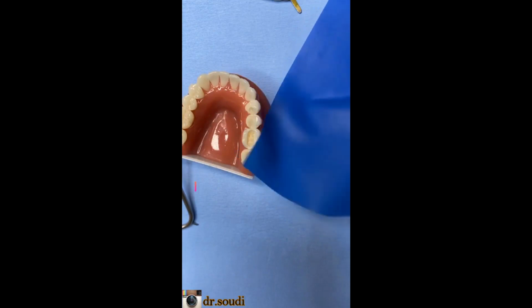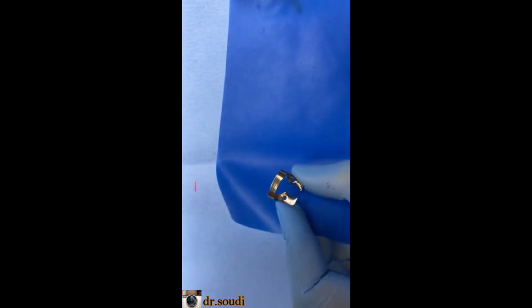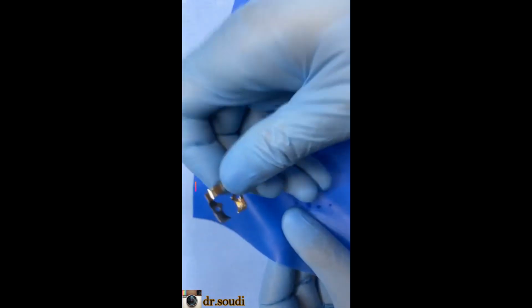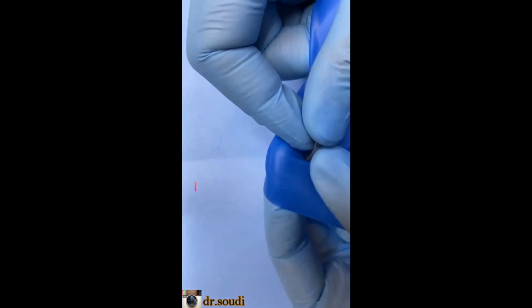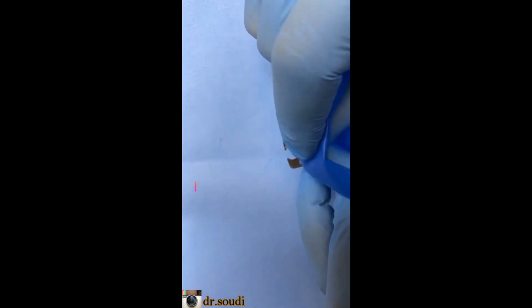If we will work with a wingless clamp like 26, this technique is called the bow technique. Bow means this part of the clamp. Our clamp will be like this in the tooth. Okay, it's clear now, right? So we will stretch the sheet like this. Stretch your sheet. Pass your arms under the sheet. Now you have only the bow above the sheet, right? From downward you got the 2 arms. This is the bow technique.